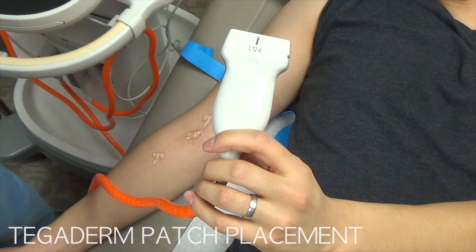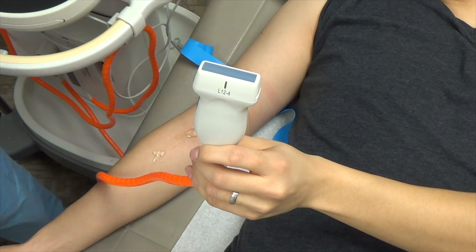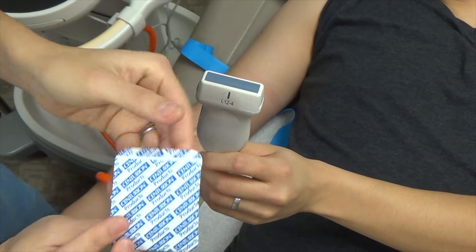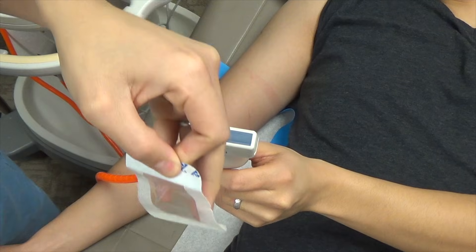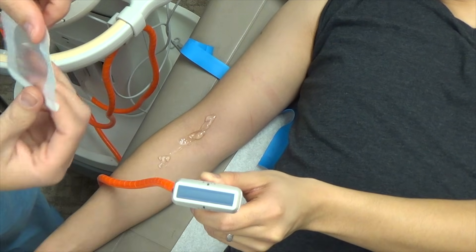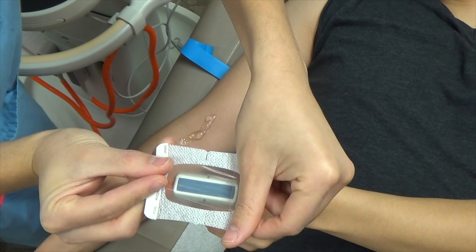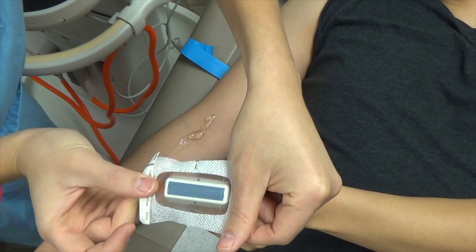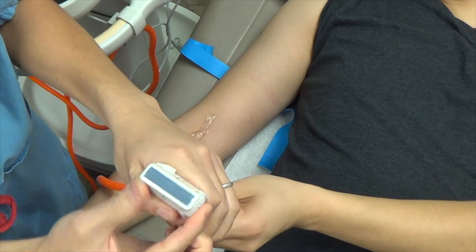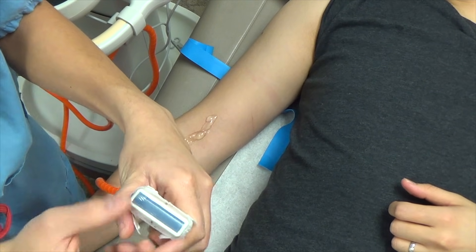Now we're going to use the Tegaderm and place it over the probe. Always use a linear probe when doing peripheral IVs. Open the Tegaderm fully — it's a small rectangular piece — and with someone holding the probe, place the Tegaderm right in the center. Pull it taut to avoid air bubbles, giving you a semi-sterile ultrasound probe cover. You can use your gloved hand to smooth out any remaining air bubbles between the Tegaderm and the probe.